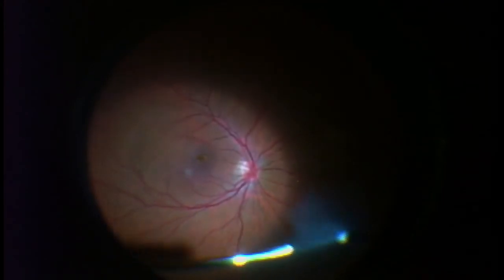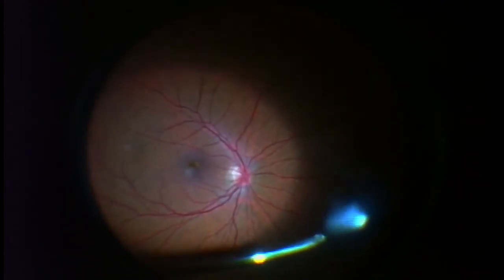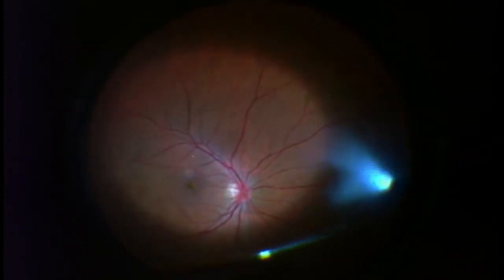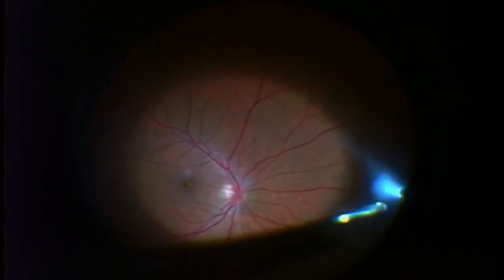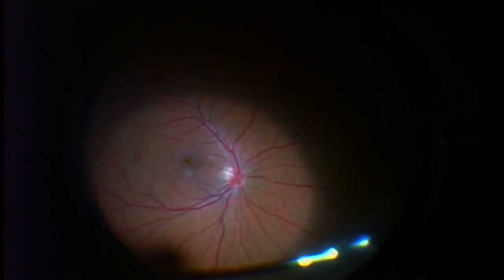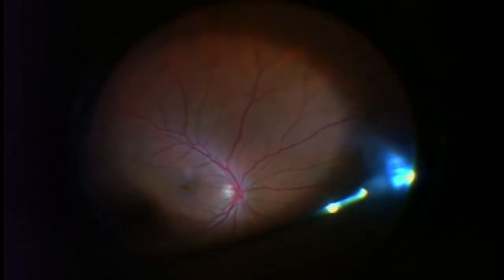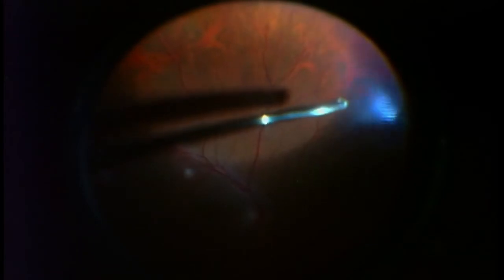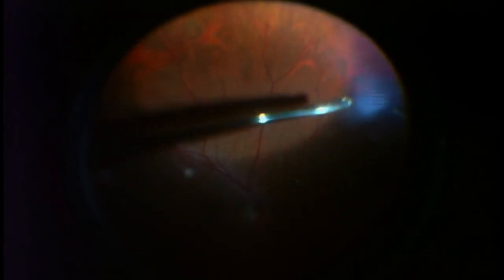As you can already see, there's been a substantial clearing of the vitreous. My interest is to remove most of the peripheral vitreous, which is the vitreous over on the side. He's got an otherwise very healthy eye. There's some wetting solution being put on the cornea so I can have a crystal clear view while I operate.